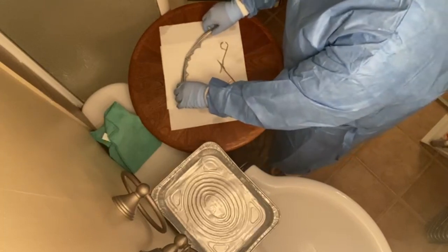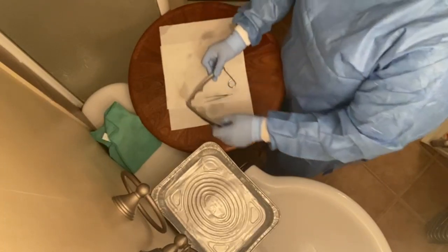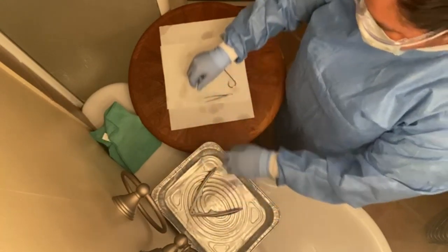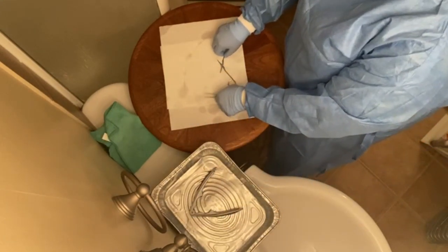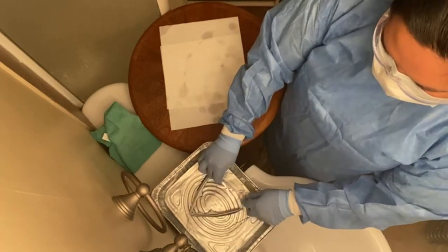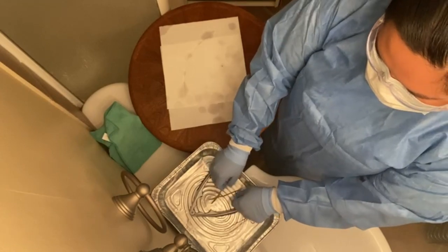Place instruments in an appropriate high-level disinfectant and follow the manufacturer's recommended contact time. Disinfectant solutions kill most bacteria, viruses, and fungi on instruments, making them safe for handling and preparing for sterilization.